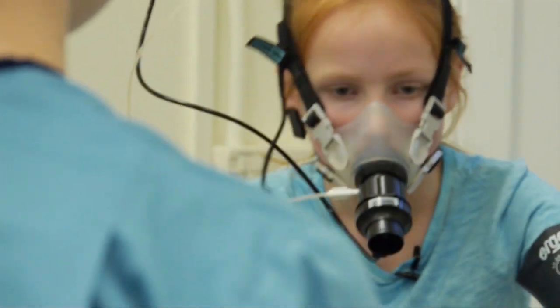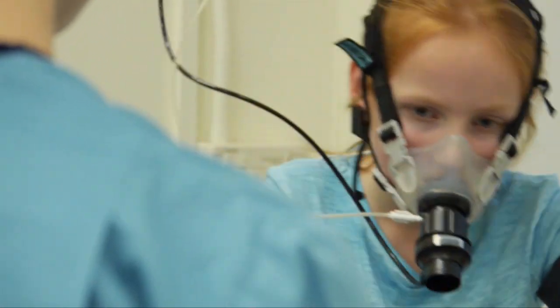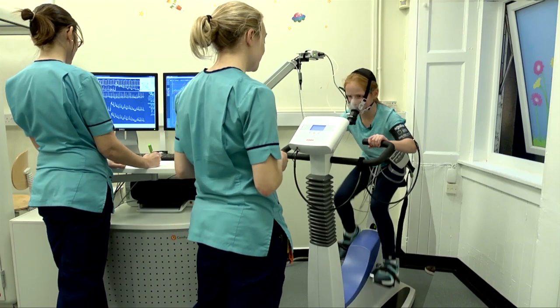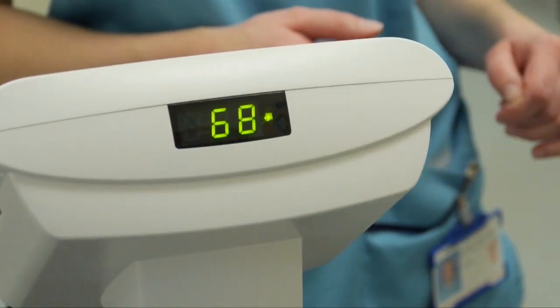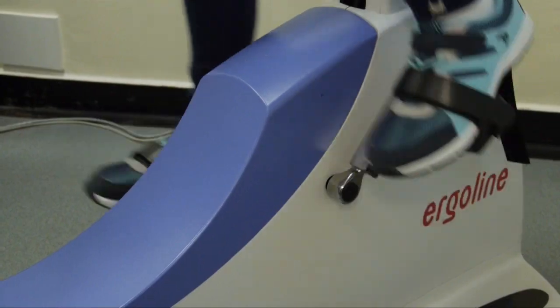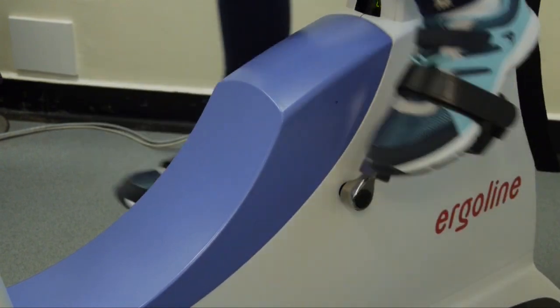Well done — we're almost there. Can you push it up to 70 again? Keep going, keep going, one last push. Almost at the top of the hill now. Keep going. One last little bit. Keep that going for as long as you can and then just stick that hand up in the air.